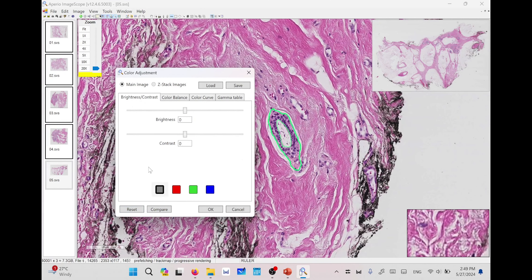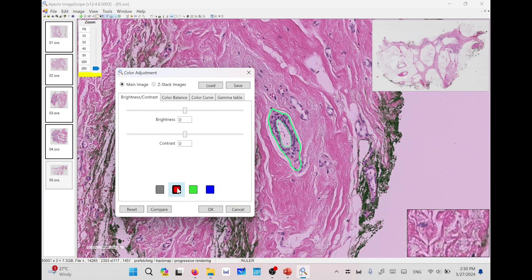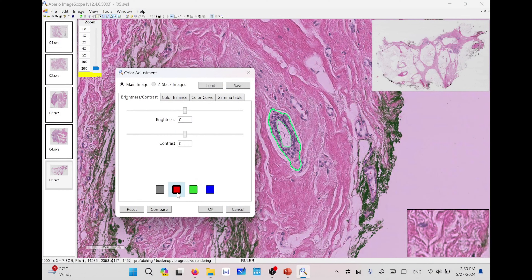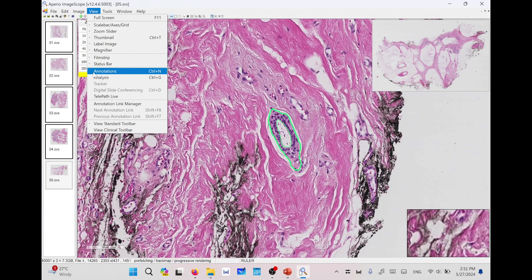In the brightness and contrast settings you can handle individual RGB channels. For example, going to the blue channel and adjusting brightness will only affect the blue channel. You can decrease the contrast of green and increase the contrast of red independently. However, when working with a specific channel, modifying values there will reset all other channels to default. This allows you to manipulate each channel individually.